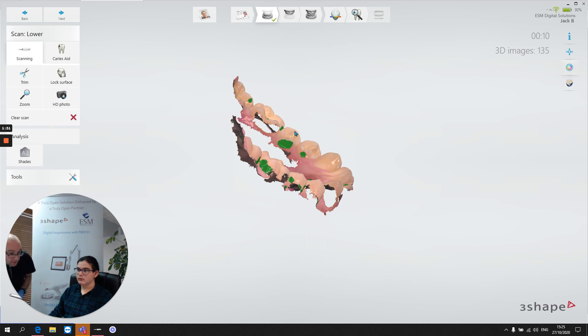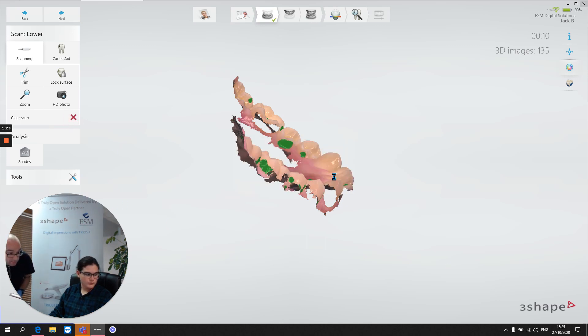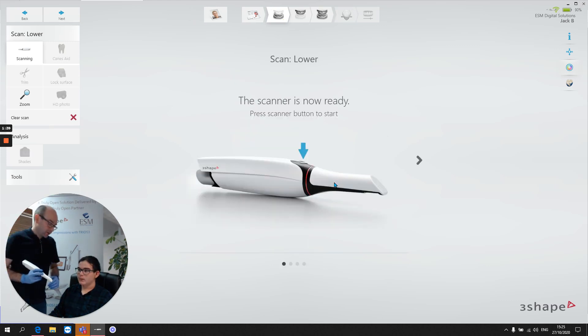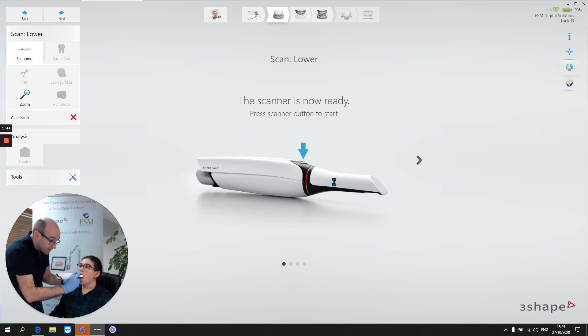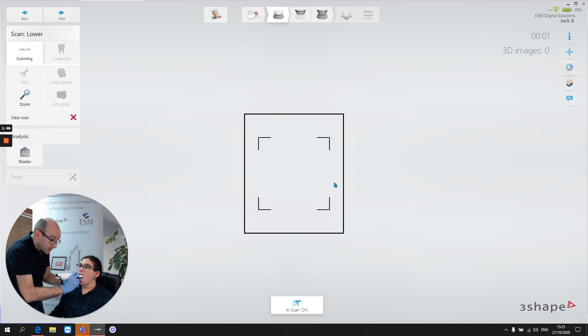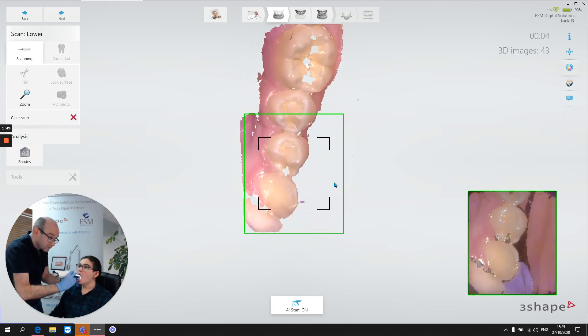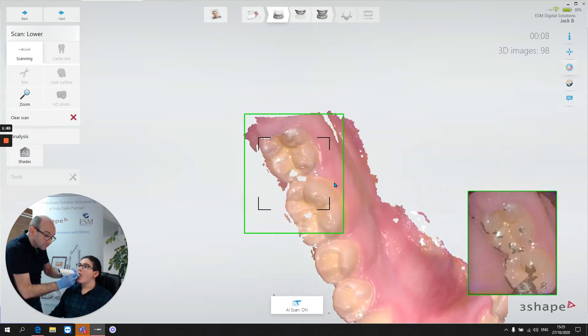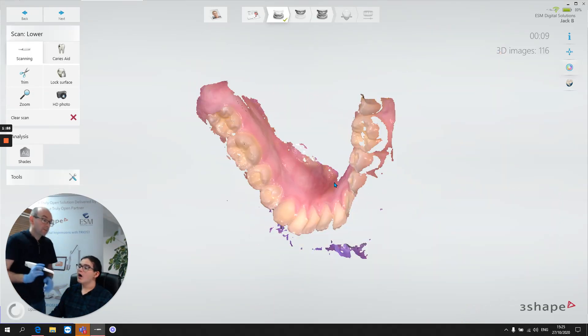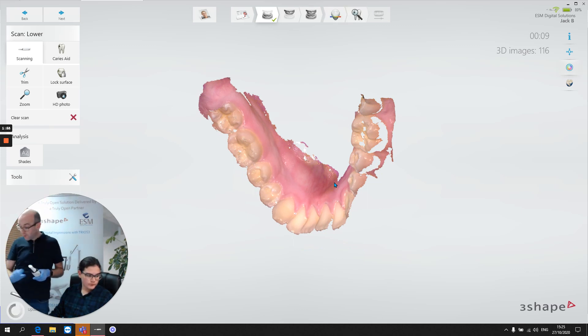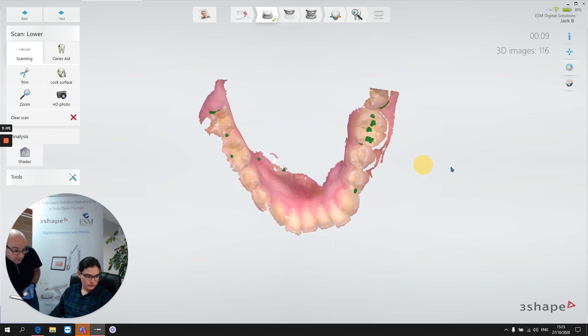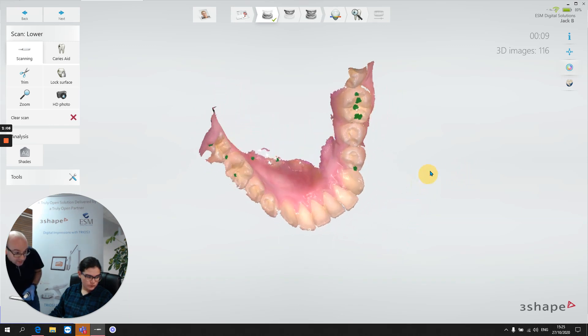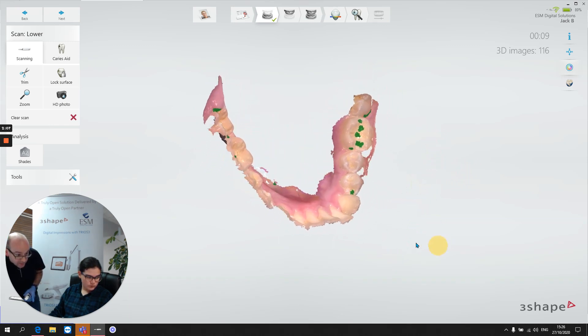What I'm going to do now is I'm going to clear that and I'm going to go through a bad occlusal scan. If you can open up again, turn towards me please. So primary objective number one, have we captured the occlusal detail? Yes we have, and you'll argue there that we've actually captured lots of lingual information as well.